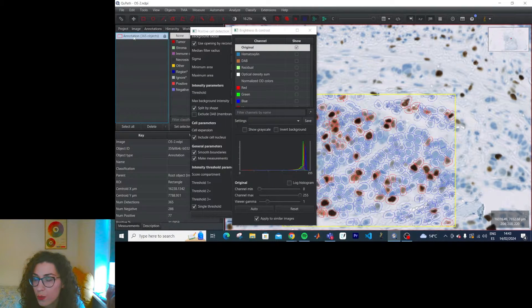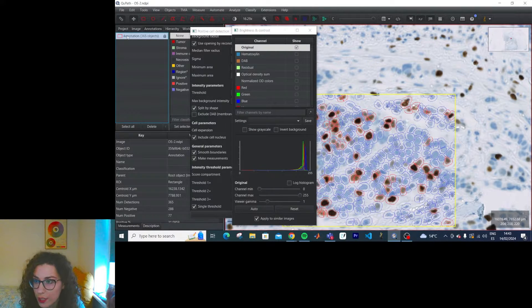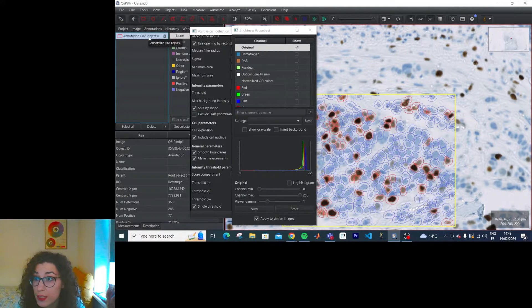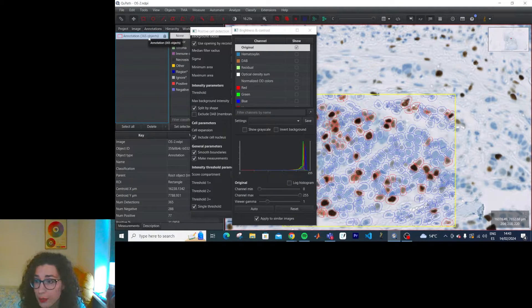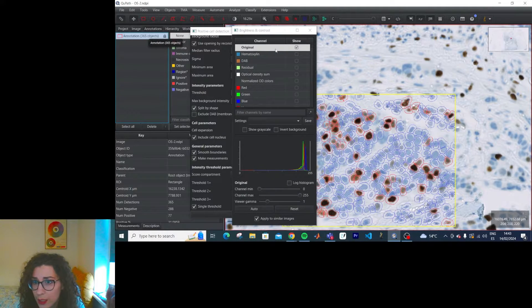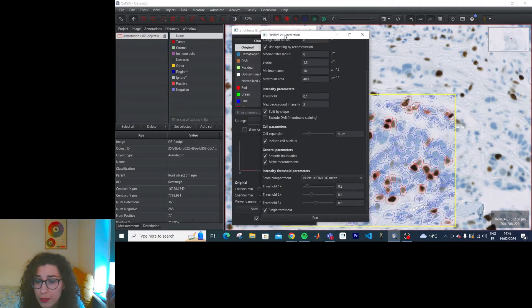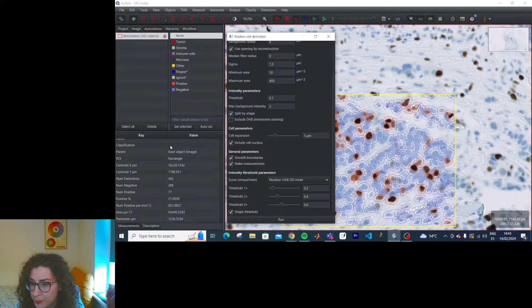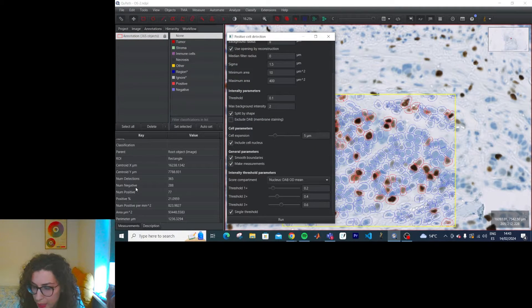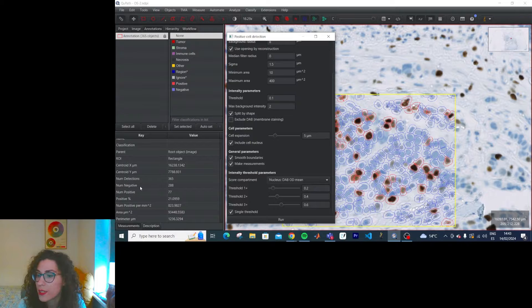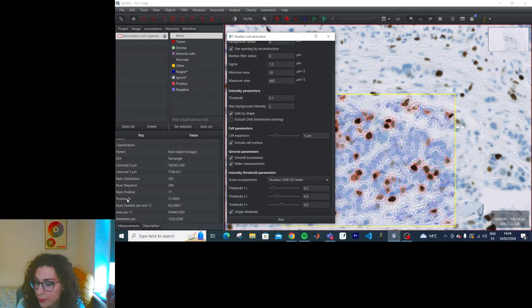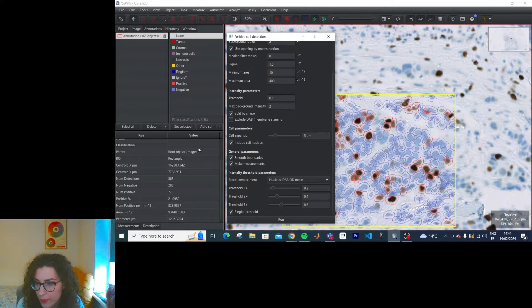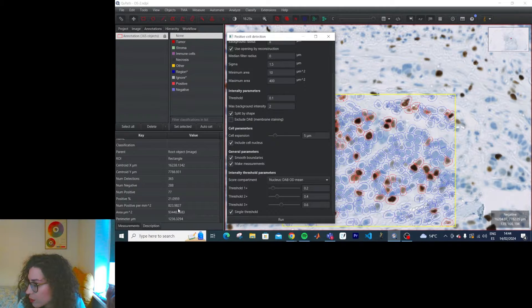So within one annotation now we have 365 objects because we have detected 365 cells, presumably. And we have automatically the number of negative, positive, positive percentage. We have measurements here. Cool.